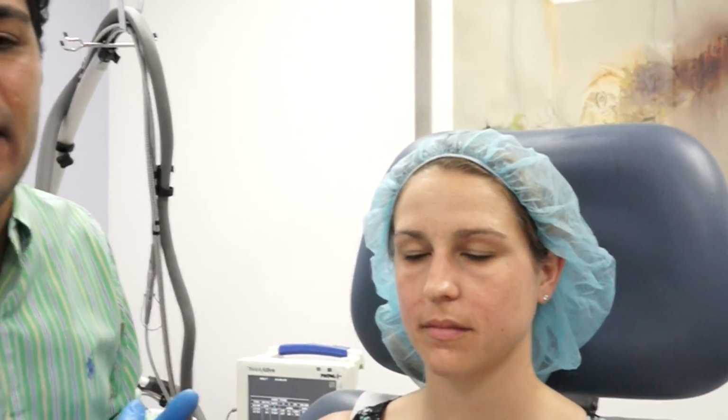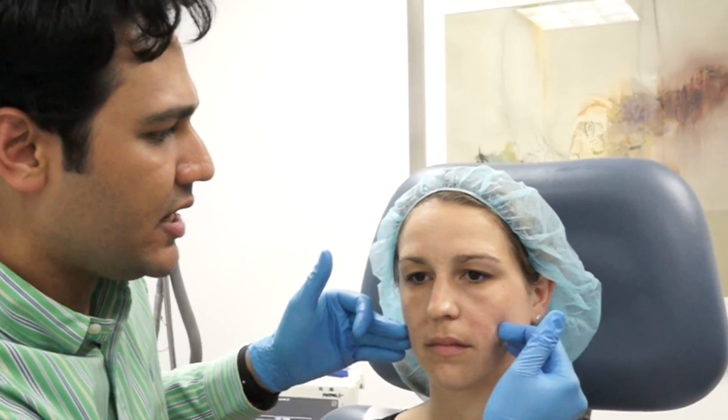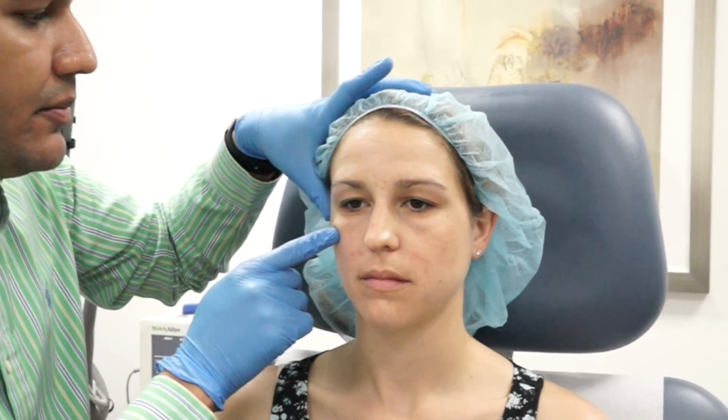Carly is a runner and a fitness guru, I guess I would say, and Carly has lost a lot of weight, and for that reason she's also lost a lot of fat in her face. And fat is important in the face because it provides structural support to the face. Particularly as you get older, it becomes even more important because we start to lose collagen and elastin. So in her case, you get this almost hollowed, deflated appearance to her face. And so what we're going to do is augment with some filler along the zygomatic bone here and give her a little bit more mid-face volume.